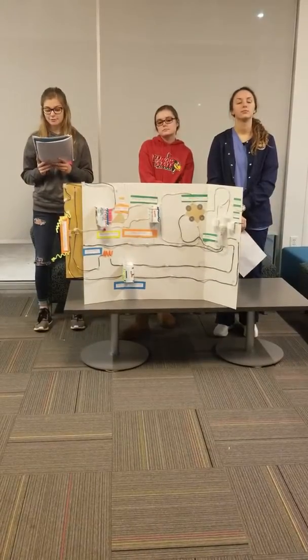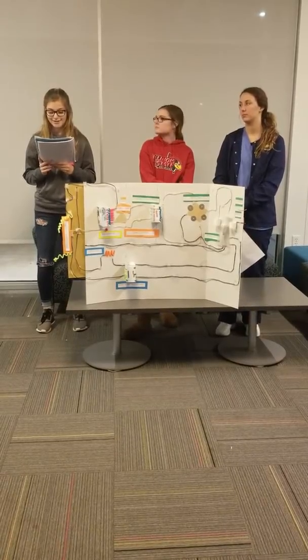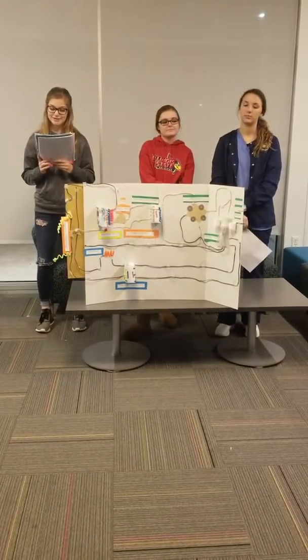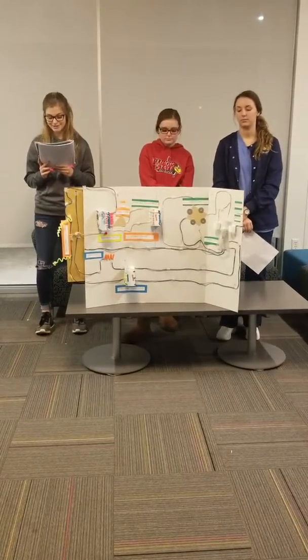The auto transformer is an adjustable transformer controlled by the kVp. The step-up transformer is used to increase the voltage from the auto transformer to the kilovoltage necessary for X-ray production.